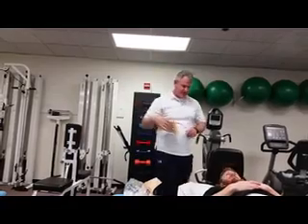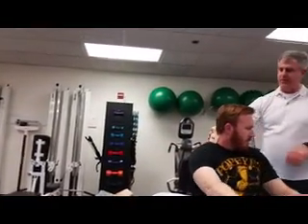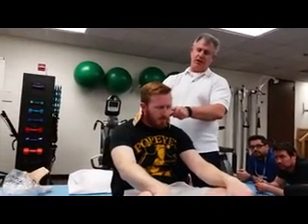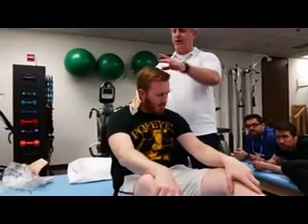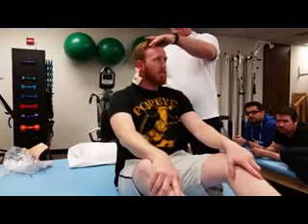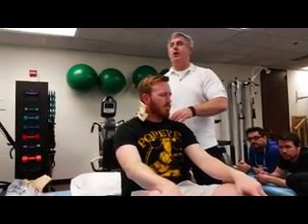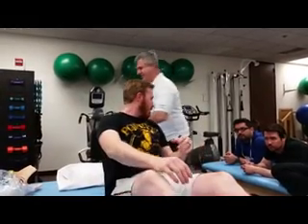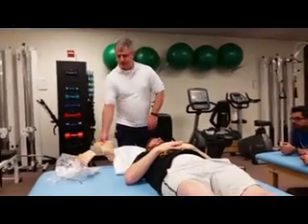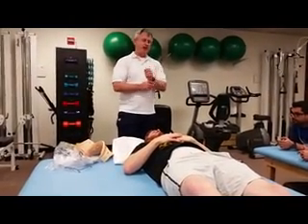So, Chris, I'm going to have you go ahead and sit up. As you see, when I put this on him, this goes below the earlobe. It has a little bit of an angle. And when I put the other side on, hopefully he'll go into more extension, more thoracic. So, he'd be in this position. Now, have you lay back down. I have to do this with him in supine. I knew I had a problem last time: I didn't take off my watch and it was getting caught.